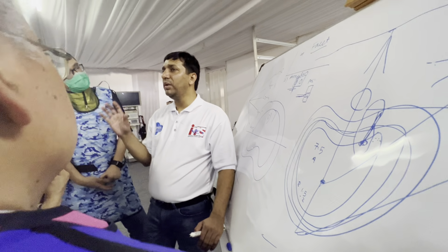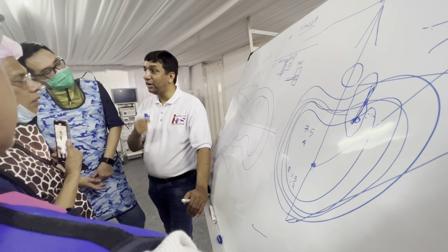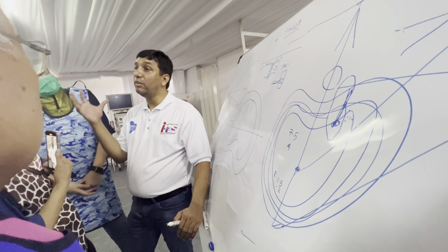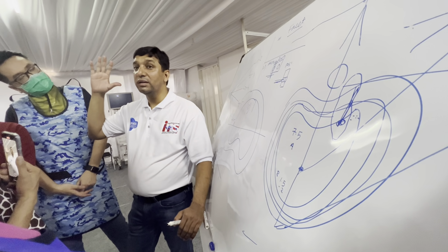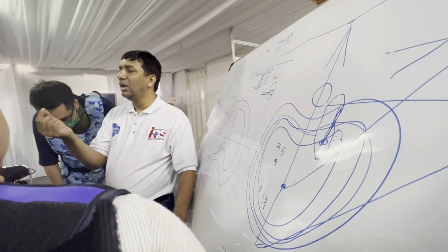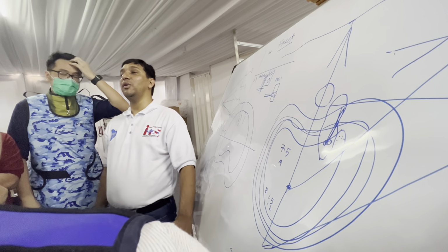But discectomy with the transforaminal approach is done through the natural orifice, so you are not cutting anything. Like here we are drilling everything, we are removing the flavum. We don't know exactly what the consequences of removing the flavum will be in terms of adhesions or something. It will come after 5-10 years. We don't know now. But this transforaminal is one of the best techniques because all the muscles you are dilating. We don't even take a stitch, and it is under local anesthesia. The patient will come back with a lot of complaints, and they will go back.